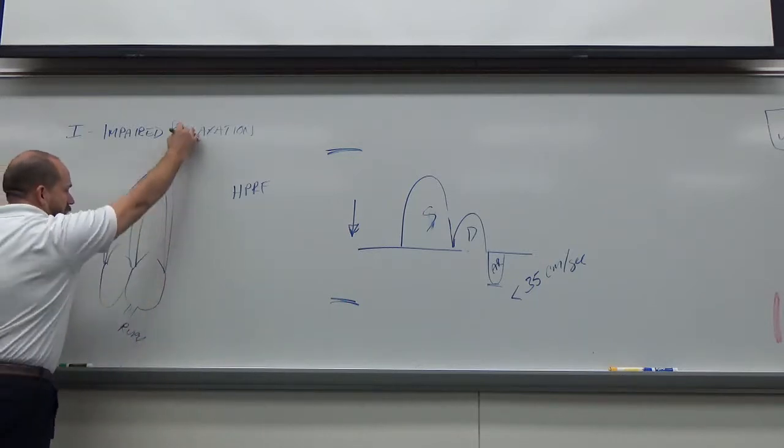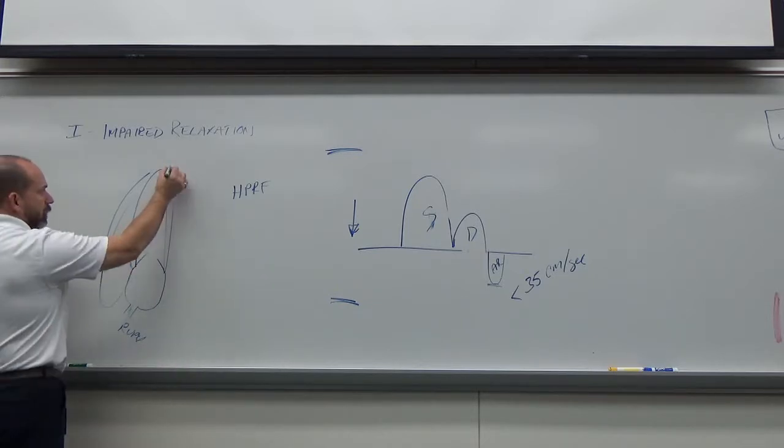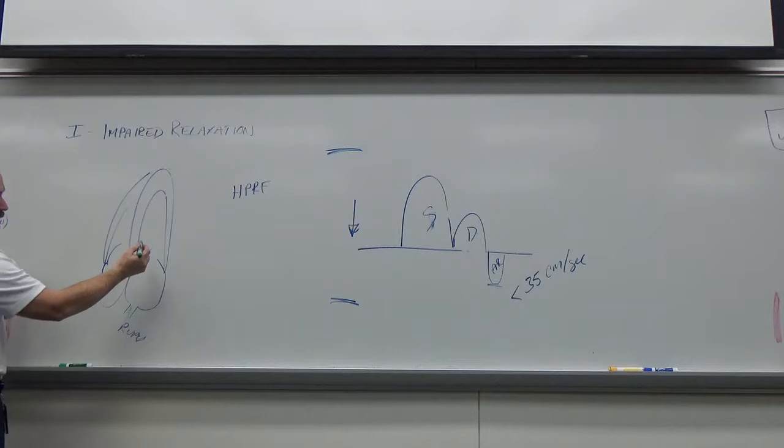Now if I've got this set up nicely, and say I kick into high PRF, the PRF is going to be determined by your depth. If it could be set normally, and I move my cursor down just a little bit more, high PRF will kick on automatically and you won't know that it's doing it unless you're looking at the cursor in the reference image above. If the other cursor's out here, probably not a big deal, right? Because there's no movement. Well, there's movement, but there's not high velocities out there.